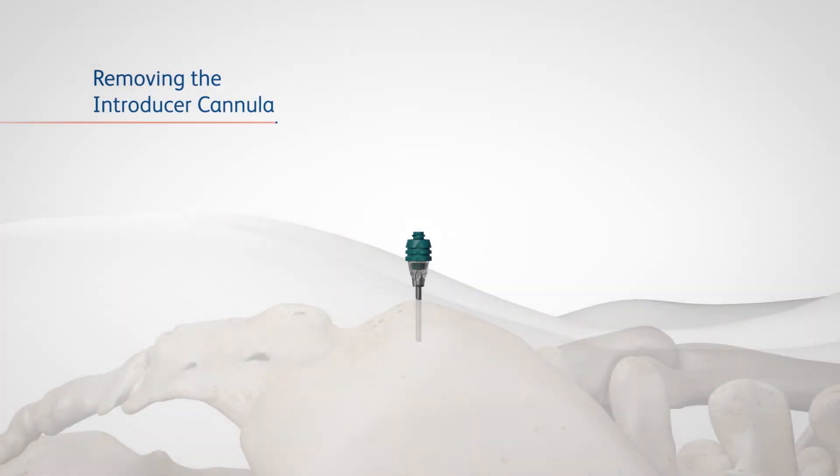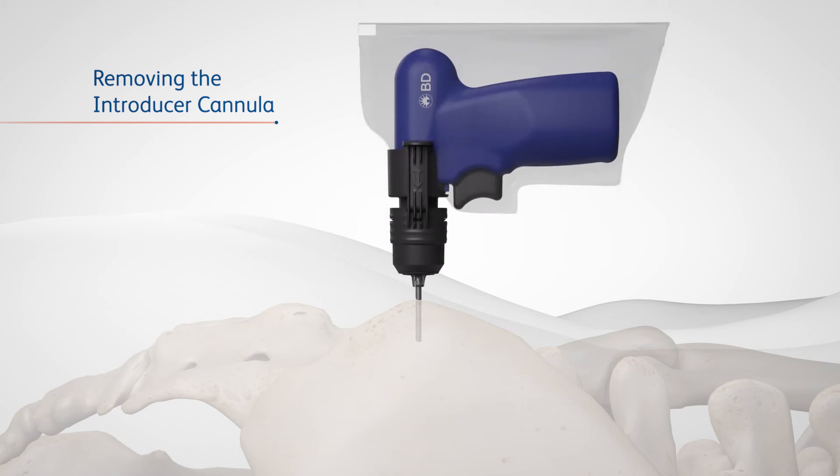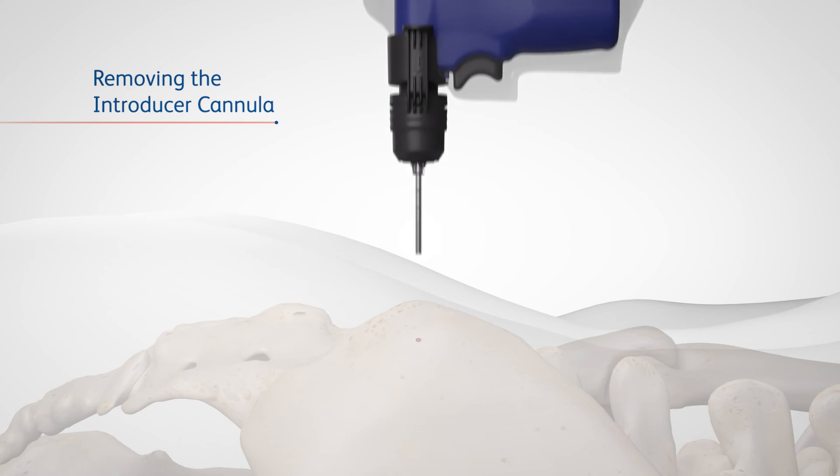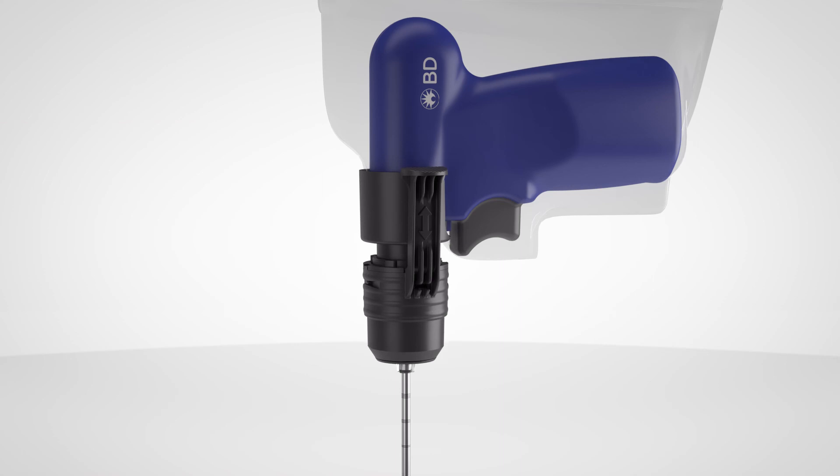When the procedure is complete, connect the power driver to the introducer cannula. With the trigger engaged, pull up on the power driver until the introducer cannula is completely removed from the patient. Then detach the introducer cannula from the power driver.